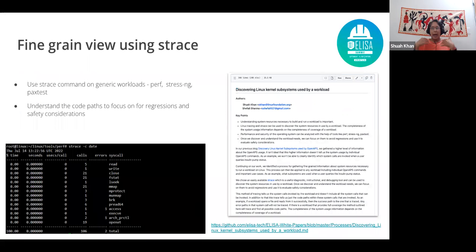So once we had that picture, this work has happened, and then we wanted to go into OpenAPS different commands. Like, for example, what happens when a user says, what's my insulin level? So we started out doing that, but like Kate mentioned, we do not have all the rigs. So we won't be able to use OpenAPS in the way it's supposed to be used without all the hardware and such.